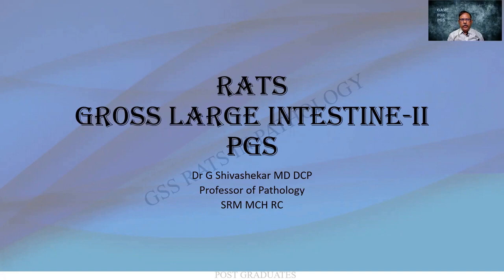We shall be continuing with the gross pathology of the large intestine. In this session, we shall be seeing the neoplastic lesions of the large intestine. I hope you people would have found the expansion. It is gross and microscopy explained.